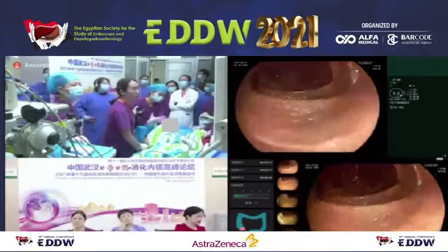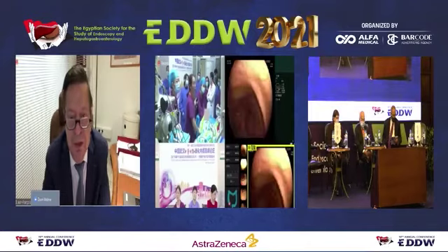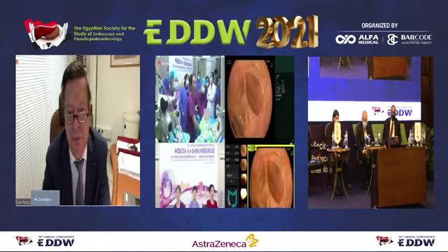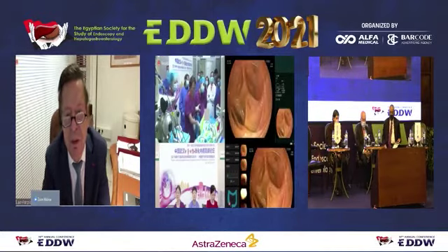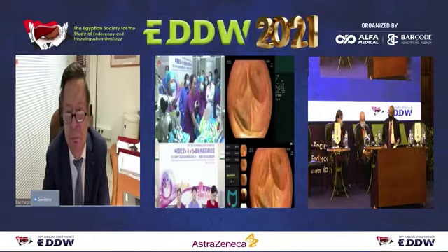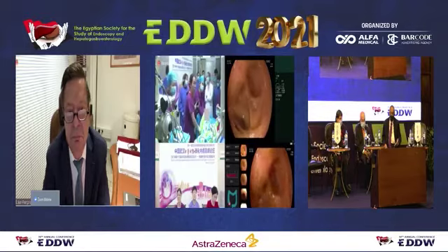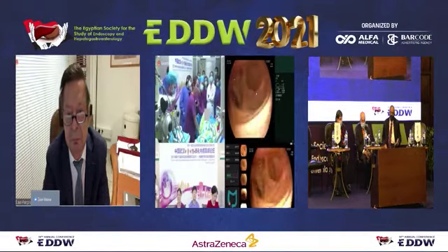Now we are at the cecum. One point is important, and I told my Egyptian friend: when you do artificial intelligence, you need to have a totally clean colon. Yeah, that's very important. It's the first important thing before the examination.